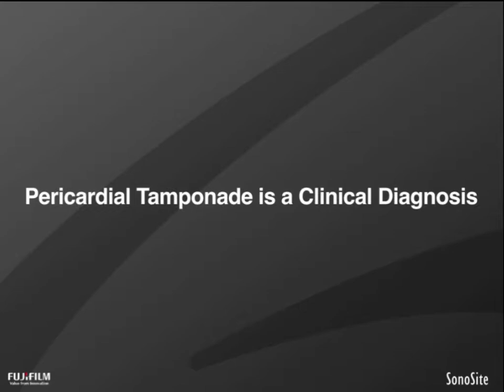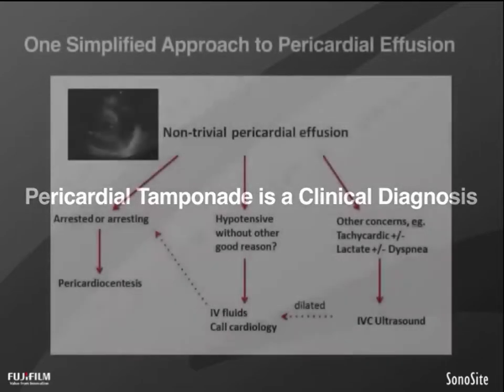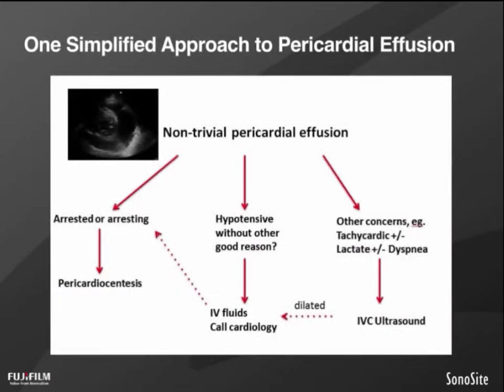I see many cases where novices are very tempted and in fact cannot control their eagerness to tell me that there are echocardiographic features of tamponade. When I ask them what those features are, they say something about chamber collapse, but typically reverse the cardiac cycles, and really they're better off resting on their years of experience as a doctor rather than trying to masquerade as an expert echocardiographer. So please remember this, and we will review an algorithm that I hope will be of use to you here.